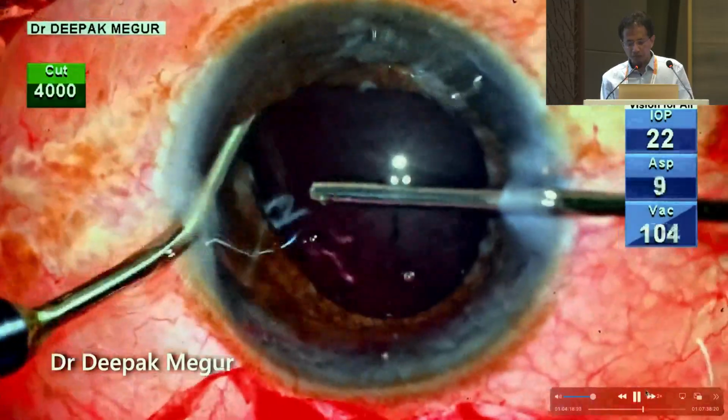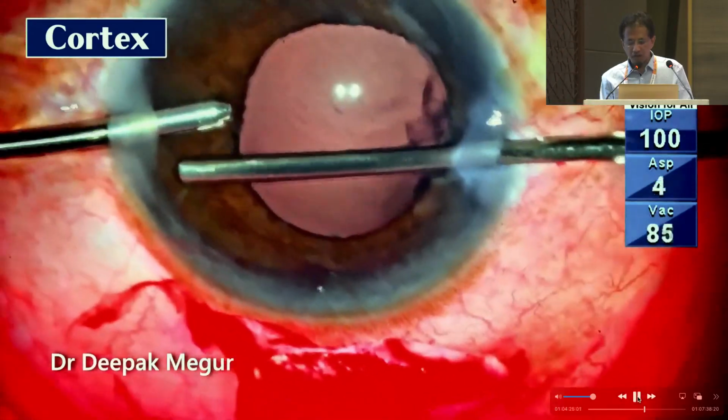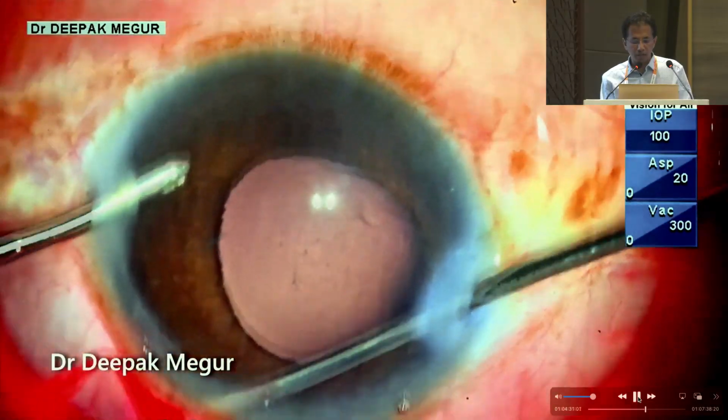So you're going to do the anterior vitrectomy, and one of the most commonly asked questions is, can we manage any of these cases without doing an anterior vitrectomy? Most complications which happen because of any lens, whether AC lens or iris claw lens, are because you have not managed the vitreous well. So managing the vitreous well is probably the most important message which I'd like to give.